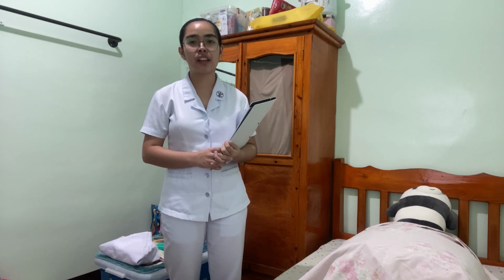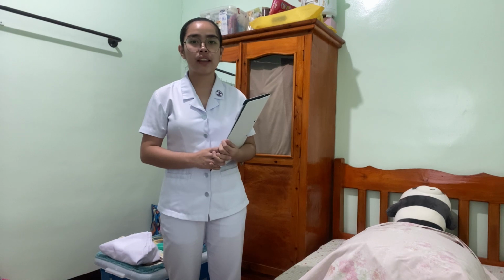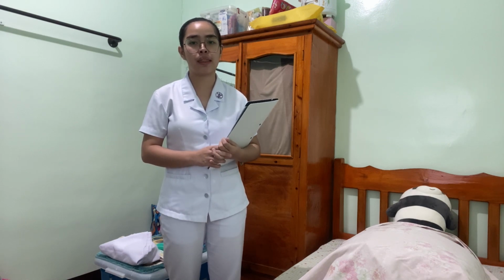So urinary catheterization is usually used when people are having difficulty urinating naturally, or this could also be used before or after a surgery when necessary. And also, catheterization is used to help in performing certain tests.